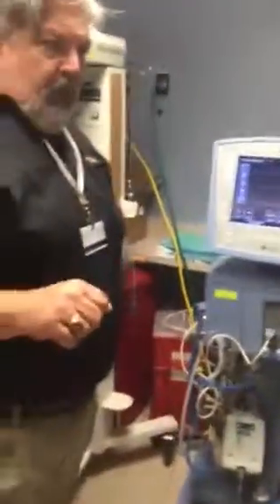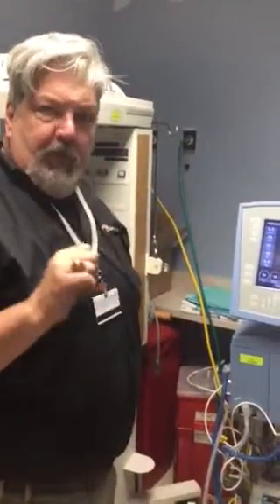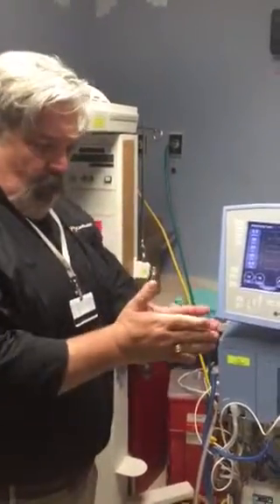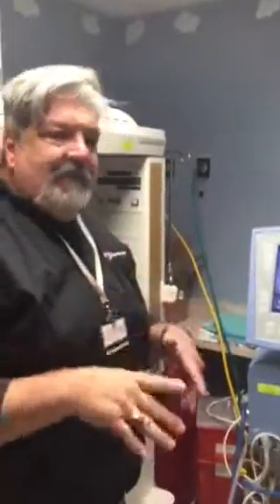Volume guarantee is not a mode of ventilation. It's not going to change how you ventilate your baby. All volume guarantee is a safeguard to prevent wide swings in your tidal volume. Okay? What you're going to do is set a target tidal volume for your baby.